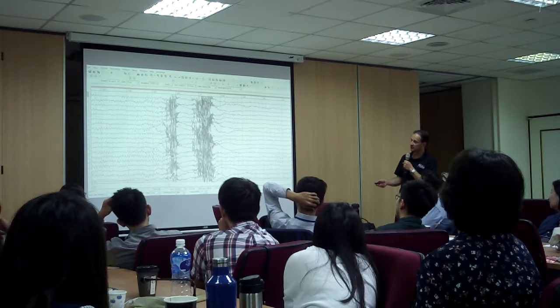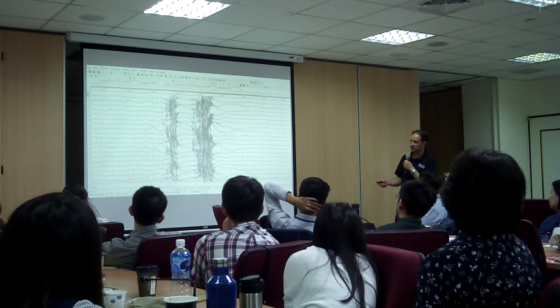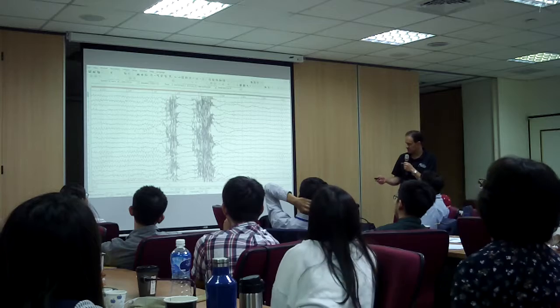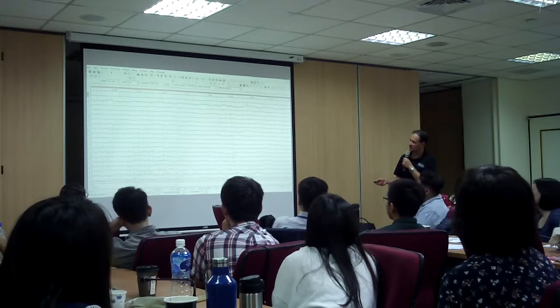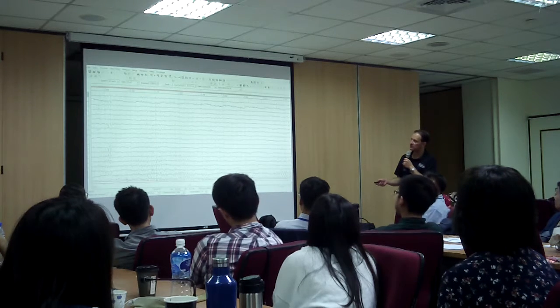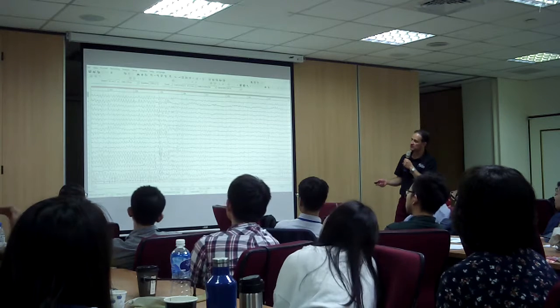So we got, what's that? Movement. Yeah, that's EMG. He probably was getting tired. He was tensing up his face. So you'll see that. Good. So you're identifying artifacts from non-artifacts. All right, anything else there?